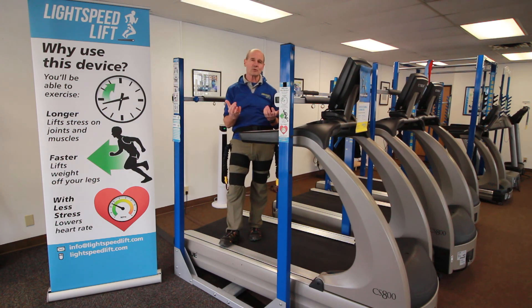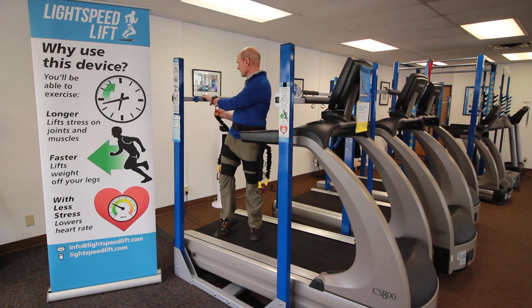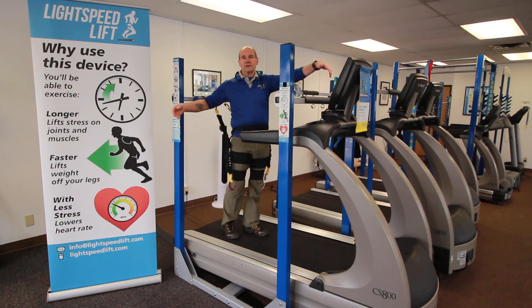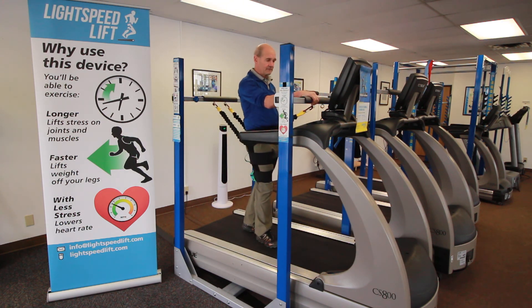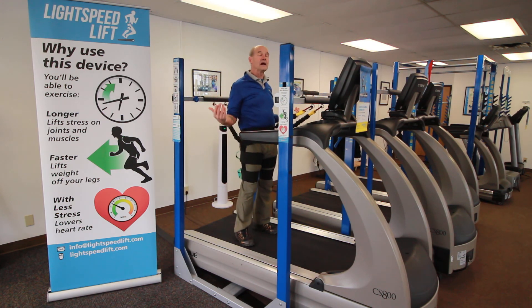I would always rather have people start with less than more. So once you've got that height set, clip the back in first. Grab the front bar, pull yourself forward so that you can clip in the front.